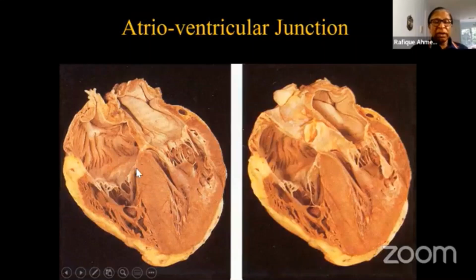Again, another section, the left ventricle and the right ventricle. The right ventricle, as you can see, is a much thinner structure compared to the left ventricle. So when we put catheters in, it is more likely to perforate than the left ventricle itself.